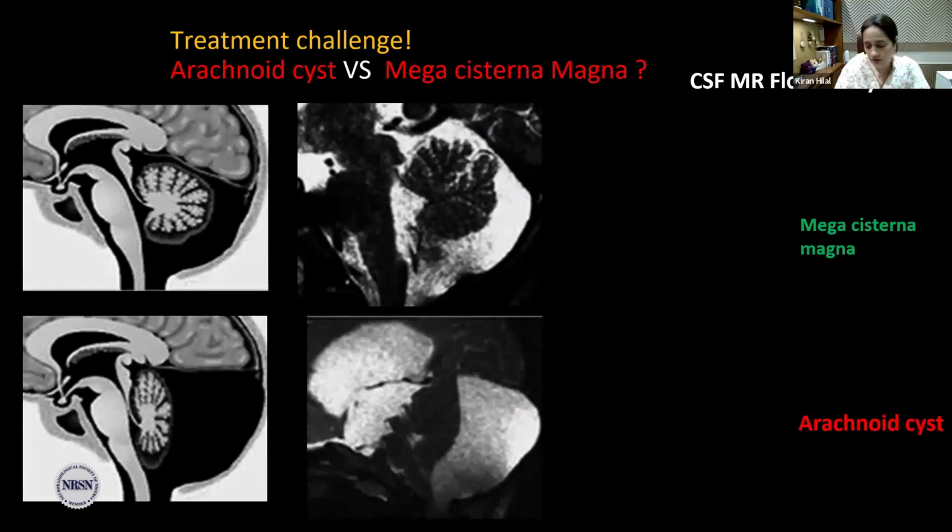So whenever a neurosurgeon asks you and they have the treatment challenge, whether to go inside or not, do the CSF flow study. If there is a flow obstruction, then they have to go inside and remove this obstruction. So yes, at times, not all the time. If you are not sure, ask for the CSF flow study.